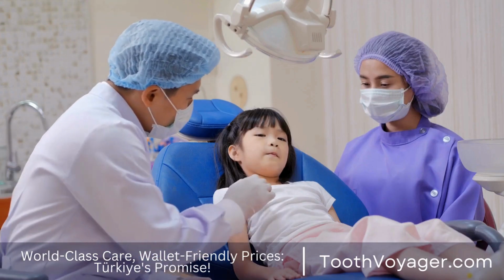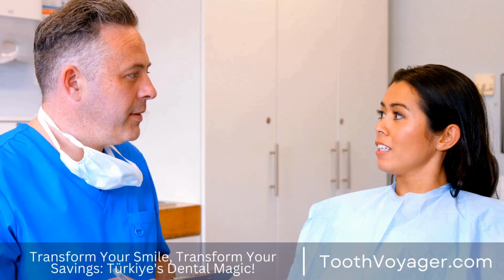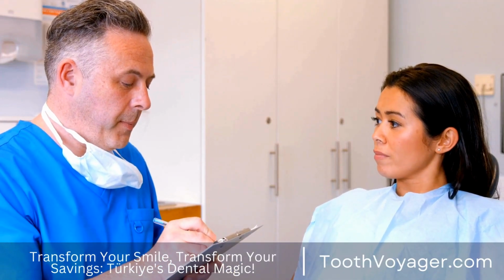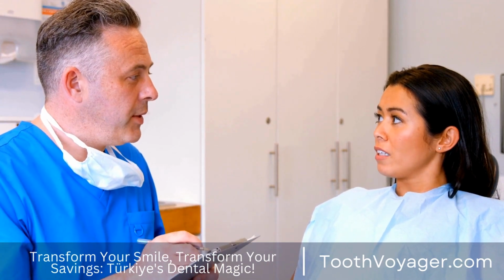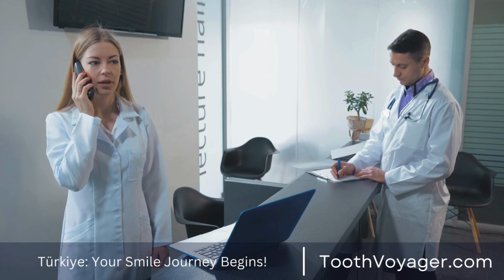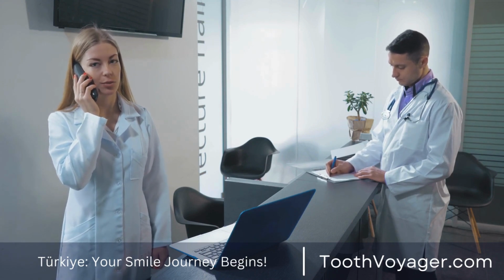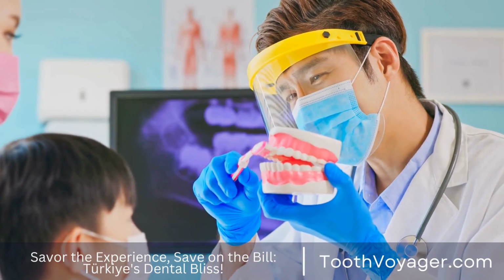Here are the primary reasons dental crowns are utilized. 1. Repair of damaged teeth. Crowns are often employed to fix teeth that are damaged by dental decay, trauma, or other causes. The crown can be used to protect and strengthen teeth that have been injured and stop the development of decay and further damage.